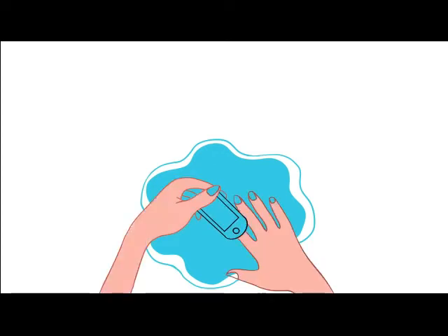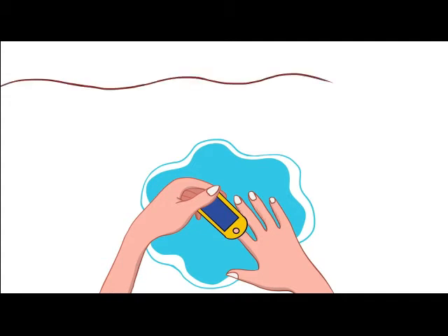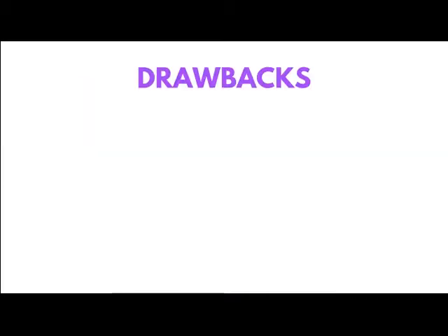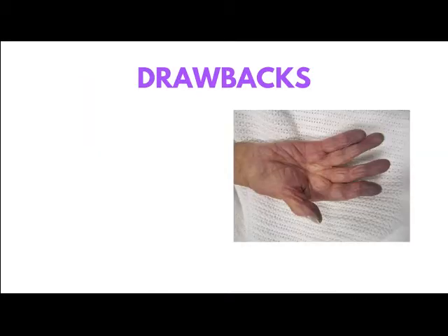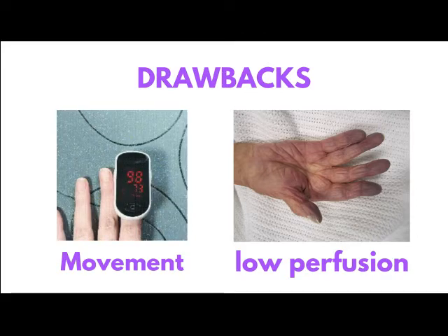Measuring the arterial oxygen saturation by pulse oximetry using a fingertip sensor is commonly used in the management of CF patients. Transmission pulse oximetry is a non-invasive, accurate, and simple means of monitoring oxygenation, but this technique has some drawbacks. It can fail in accuracy when low arterial oxygen perfusion occurs. It is sensitive to mechanical artifacts caused by movement of the sensor.